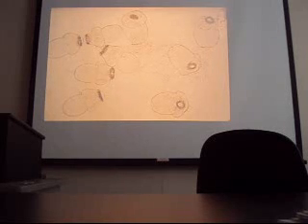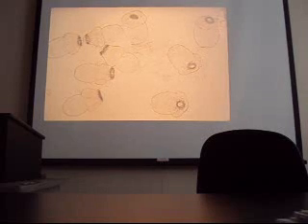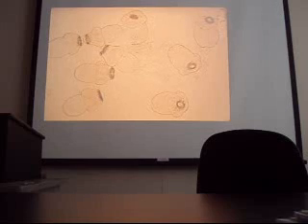They were very lucky because, remember, if they rupture the cyst and this stuff gets out into the body, you go into a severe anaphylactic reaction. So you die right there on the operating table. That's really something. Echinococcus granulosus. See, the little scolexes are armed. It's a very tiny tapeworm. It usually only has 3 proglottids.